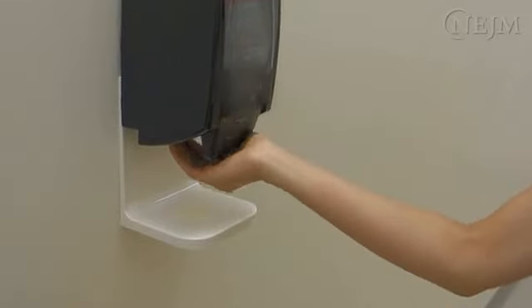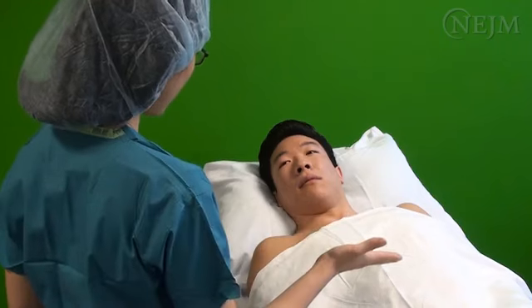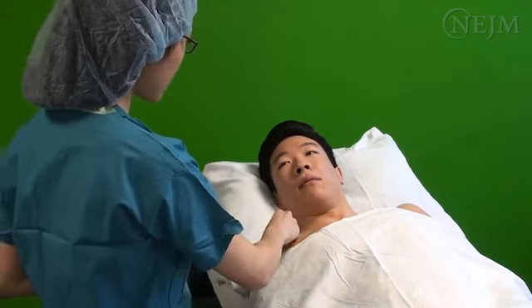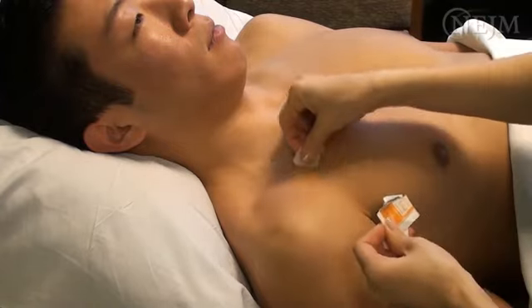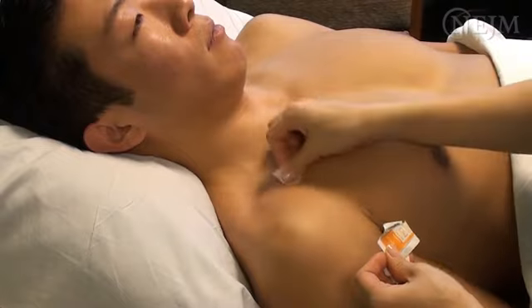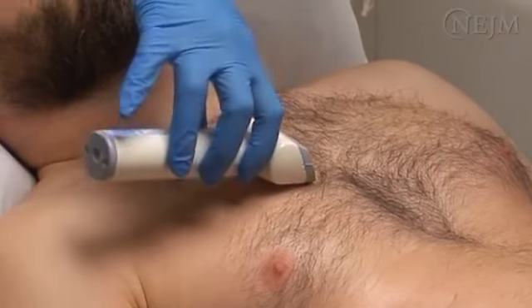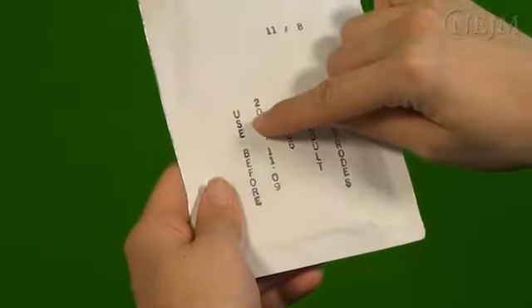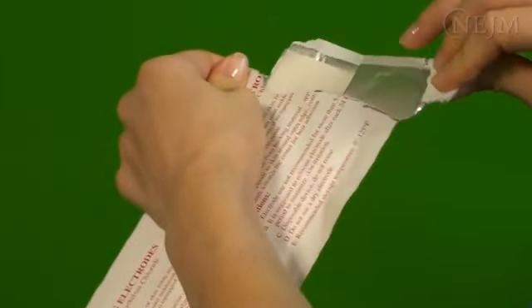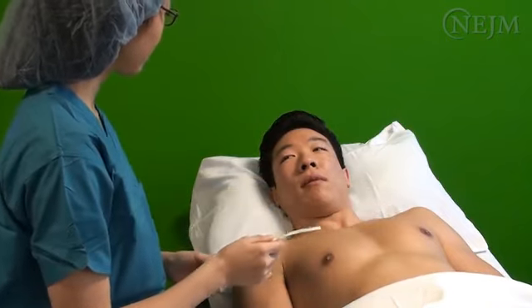Wash or sanitize your hands before entering the room and starting the procedure. If the patient is conscious, explain the procedure before proceeding. If needed, use an alcohol wipe to remove excess oil from the skin to improve the electrical conductivity. If the patient is hirsute, consider shaving the skin in the areas where the electrodes will be placed. Check the expiration date on the electrode packet. If the electrodes have not expired, open the packet and remove them. If the patient is conscious, explain that the electrodes may feel cold.